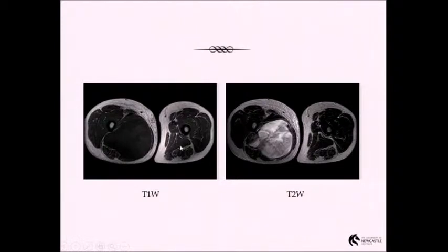And remember I said before, Damadian really started out by saying that tissue types, normal versus cancer, had different T2 relaxation times. They have slightly different T1, but the difference is more noticeable at T2. So same images, same slice, here's our T1 weighted scan, and we can kind of see that, yes, there's something going on in that thigh, it's enlarged, but it's really when we look at the T2 weighted scan, or what some people think about as the pathology scan, that we really see the differences between what's going on, this abnormal tissue, and the surrounding muscle.